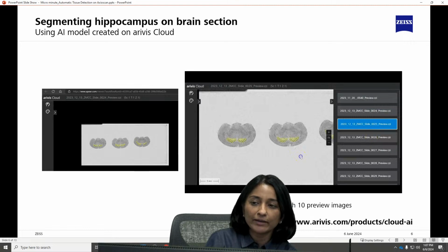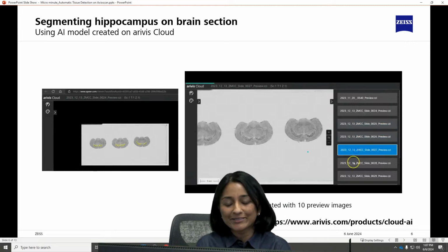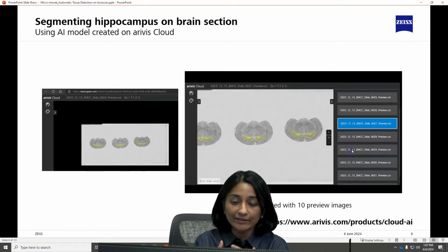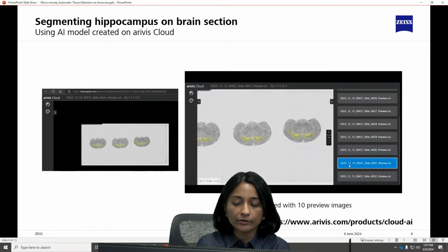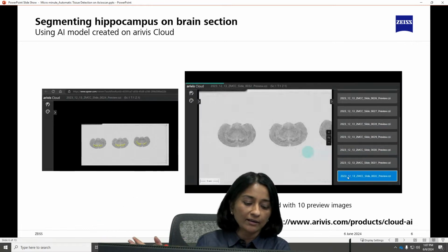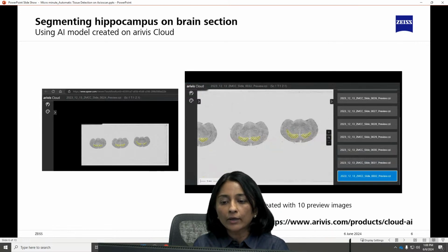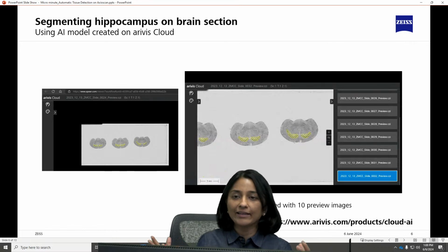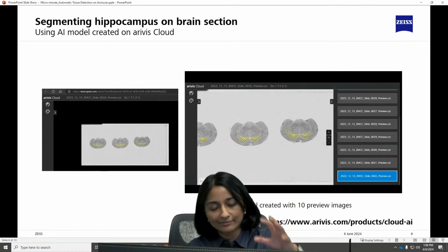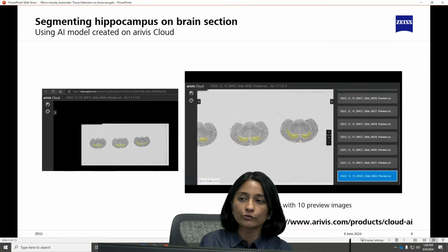In the next few minutes, this is what I am personally really excited about, because everything we spoke about so far, the marker method, the fluorescence DAPI preview method, so on and so forth. How can we avoid bleaching our samples? How can I, as a human, not have anything to do with drawing, marker method or Sharpie around the tissue, so on and so forth?